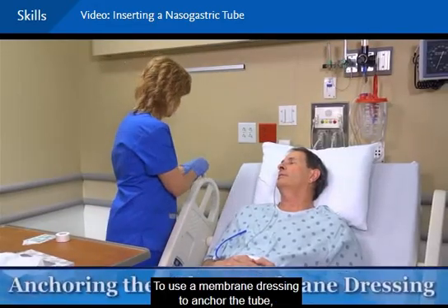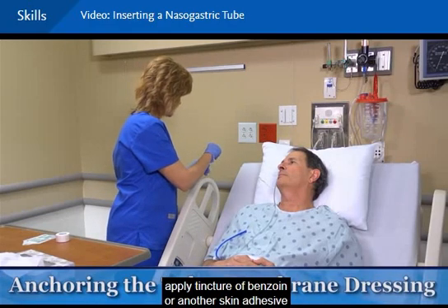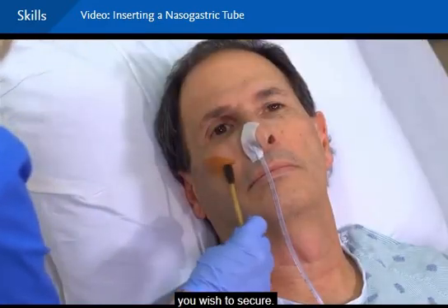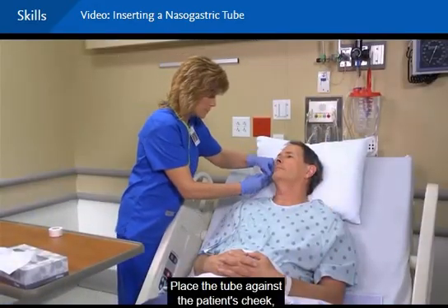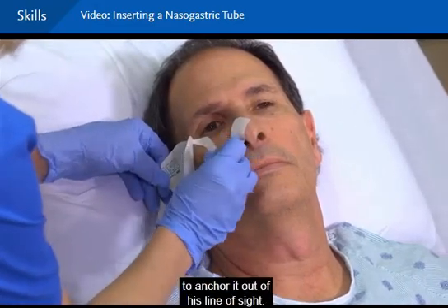To use a membrane dressing to anchor the tube, apply tincture of benzoin or another skin adhesive to the patient's cheek and to the section of the tube you wish to secure. Place the tube against the patient's cheek and use the membrane dressing to anchor it out of his line of sight.